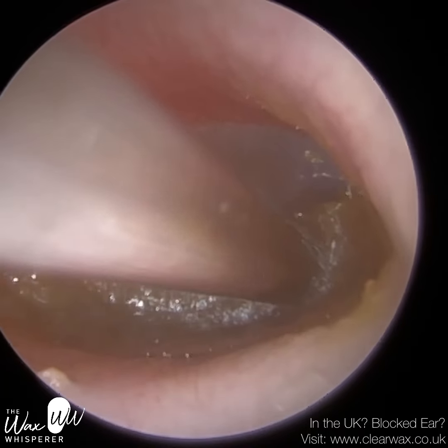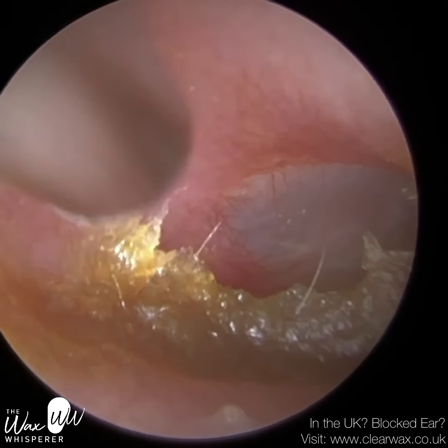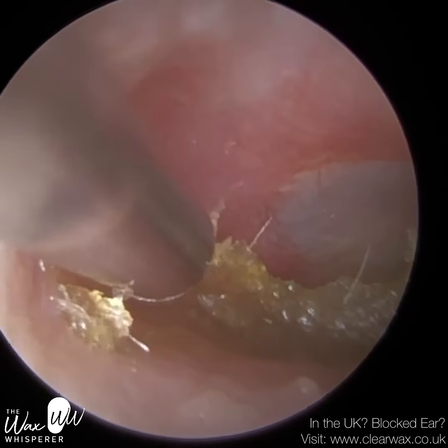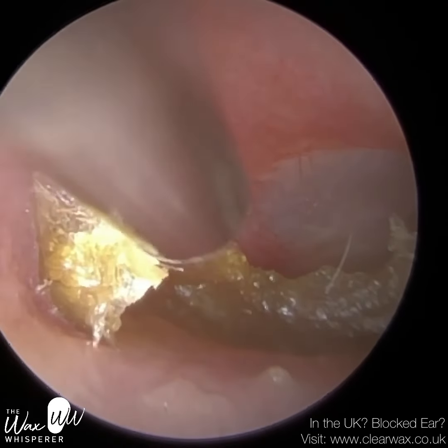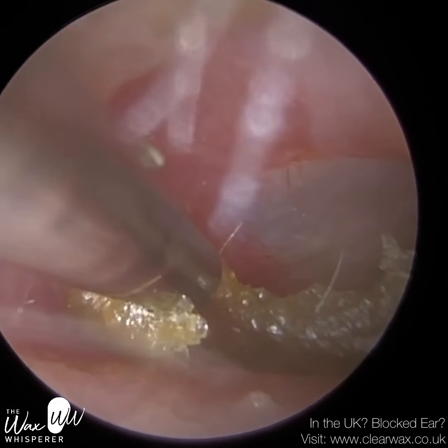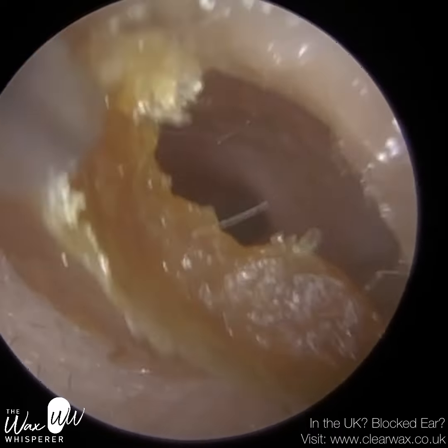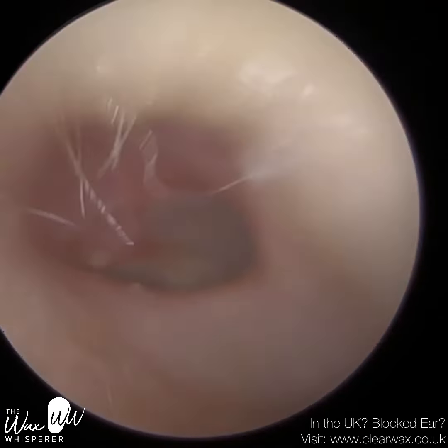Where the recess is, you can see it's curled inwards and it comes back up. I'm trying to lift this out of the recess but it's trapped, so I'm going for a different angle of attack — I'm going towards the anterior recess and just following the skin. There's the point where it's on the anterior canal wall. My thinking is: let's peel this gently off the anterior canal wall. We've got to be so careful because we're on the bony part of the ear canal — if I make contact with the canal wall here it would be really uncomfortable for the patient. And you can just see how thick this skin is. Eureka! I've got it not only out of the anterior recess but also the inferior recess. We're just going to remove this, and the patient immediately felt a lot better. The hearing aid stopped whistling at them. And that's the eardrum — you can see to the left how deep and prominent that anterior recess is.